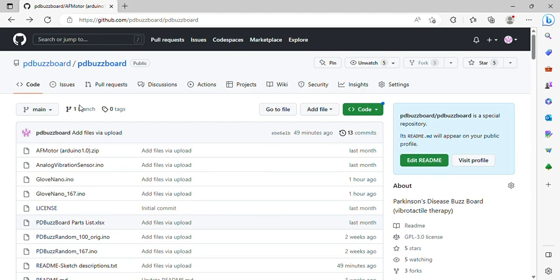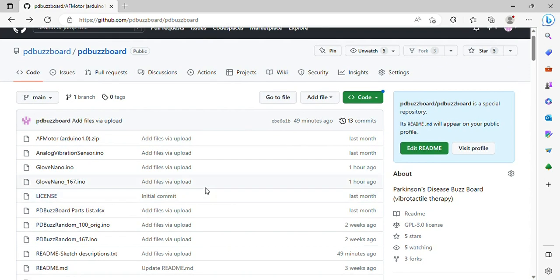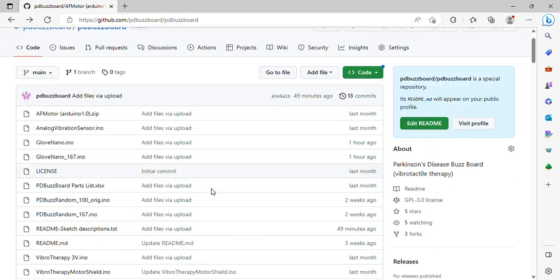I've gotten a number of questions about installation of the software and modification of the software, people wanting to make changes, and thought it would be worth taking a few minutes to go through how that's done. I'll focus on the GitHub site.